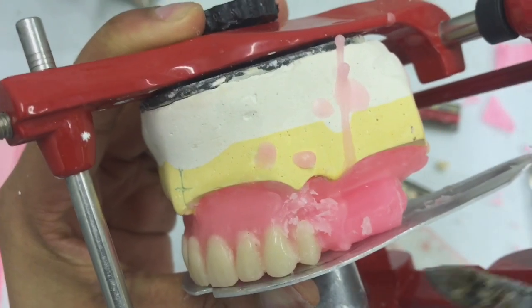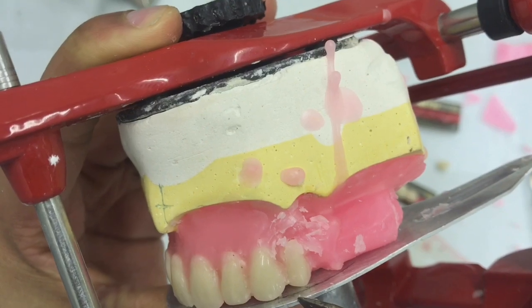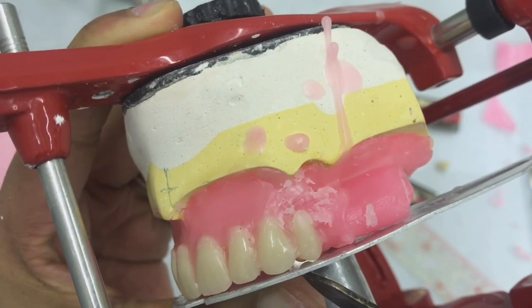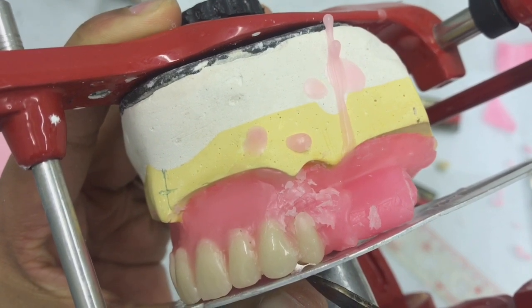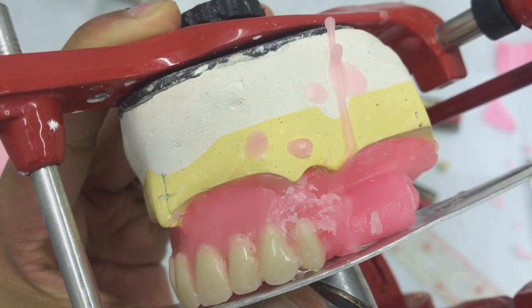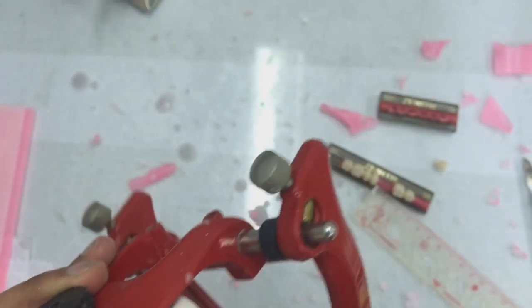You're going to see that the buccal cusp is sitting flat on the occlusal plane table. Then if you look in, you're going to see that the lingual cusp is actually off the table. You can even see by the shadow of the cusp that it's actually off the occlusal plane table. So I'm happy with that.